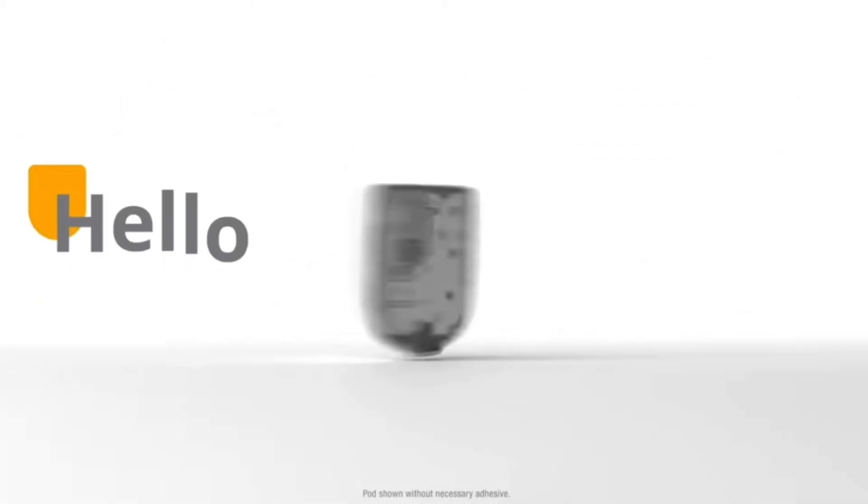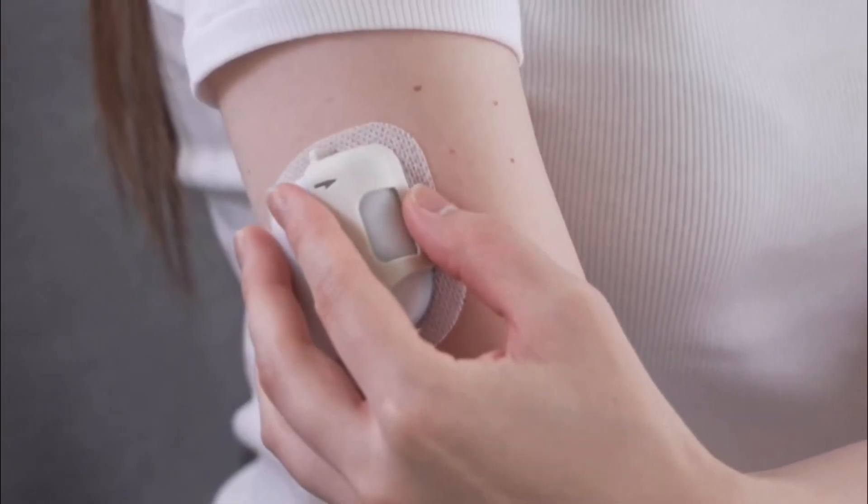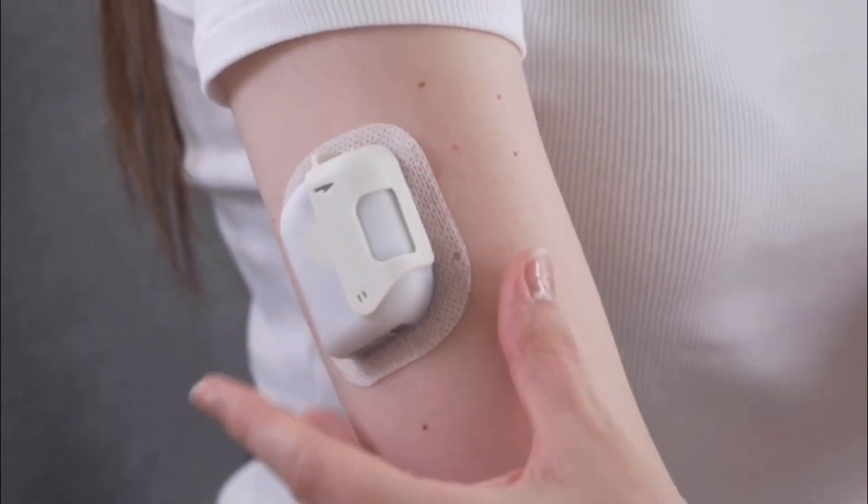What exactly is the EOpatch? The EOpatch is a tubeless insulin pump. If you're familiar with the Omnipod, this is very similar. Tubeless just means there are no wires or cables connected to the body — it's just a small pod that stores your insulin that you attach to the skin. Up until now, especially here in the US, if you wanted a full-fledged tubeless insulin pump, your only option was the Omnipod.